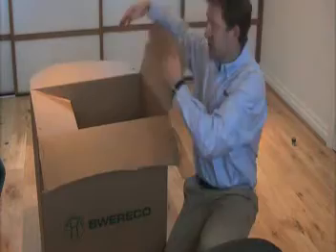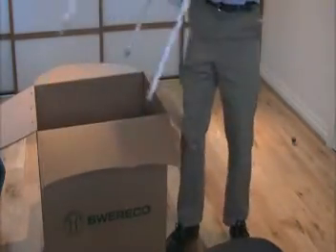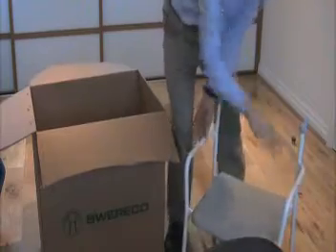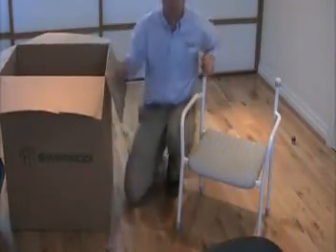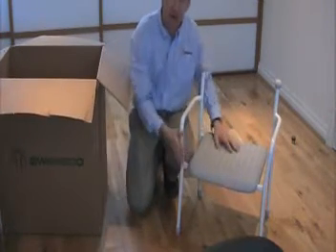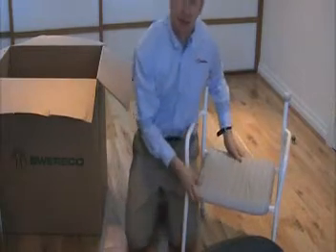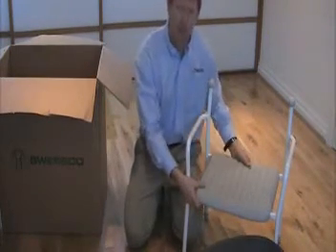We receive the shower chair in the box like this. Lift the shower chair out of the box. The shower chair is made of strong coated steel construction with a plastic seat, which allows it to be slightly warmer than other materials.